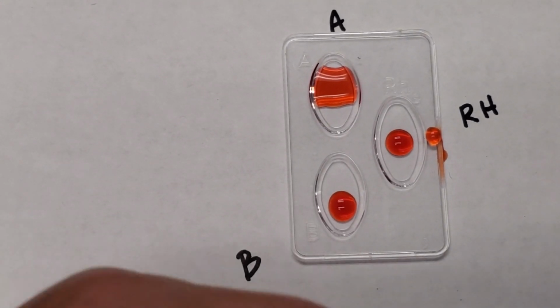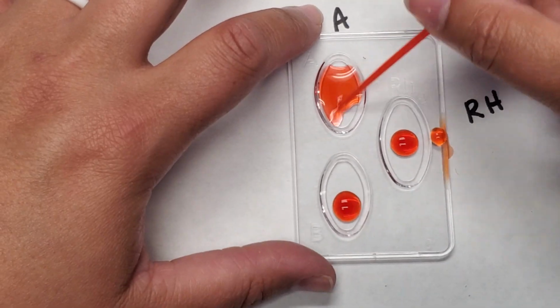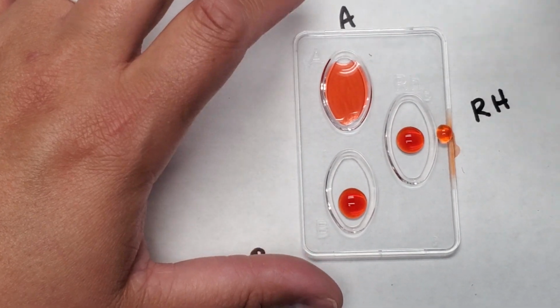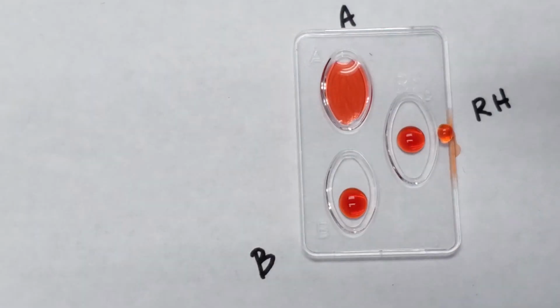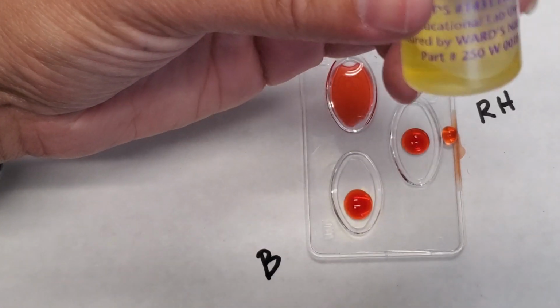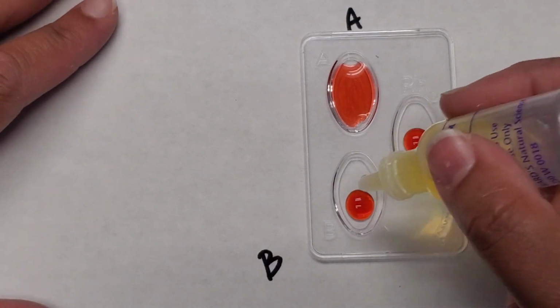So I added 3 drops of the blood and 3 drops of the anti-A antibody in the A well. The first thing I'm going to do is mix those 2 with a plastic toothpick, and I'm going to let that sit for a minute. The next thing that we're going to test is the B antigen, and we're going to mix it with anti-B serum. So this is basically a bunch of antibody Bs, okay?